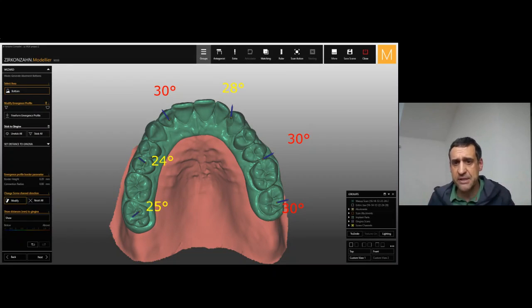But the problem is when you reach, with a normal connection, without any multi-unit abutment or without any opened T-base, like the new one, a 30-degree inclined channel screw, the milling of the framework is difficult. We really have to make sure that this area is milled correctly.